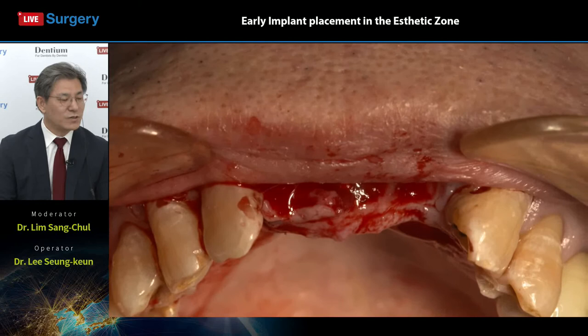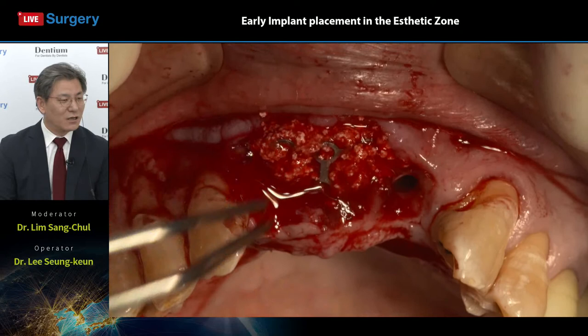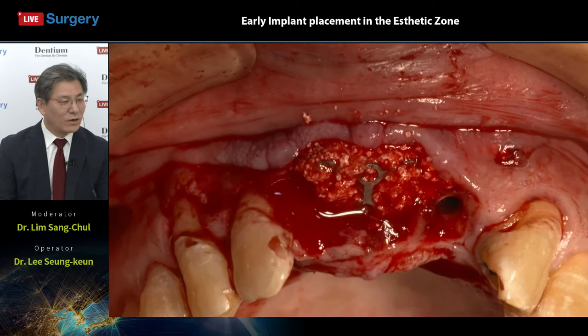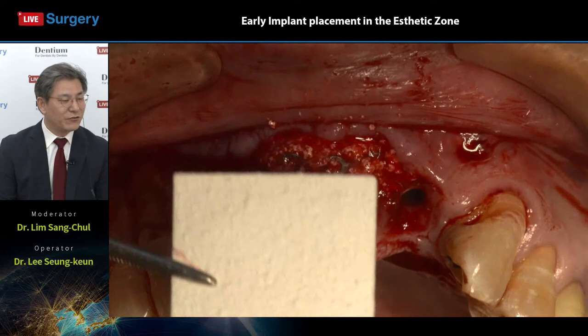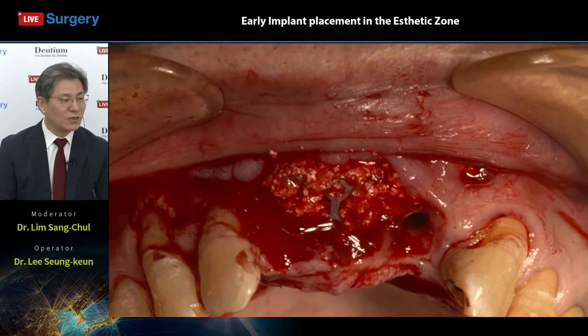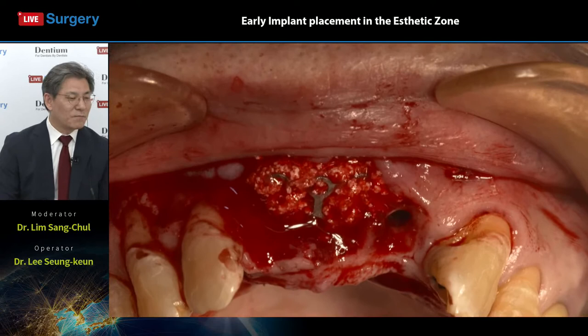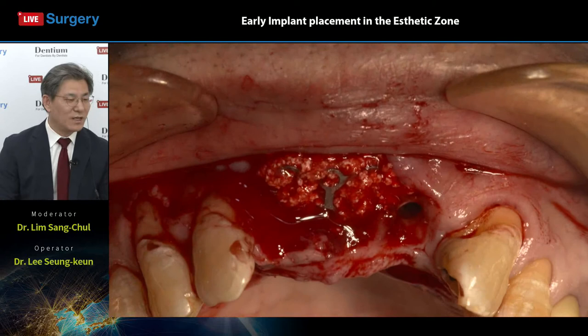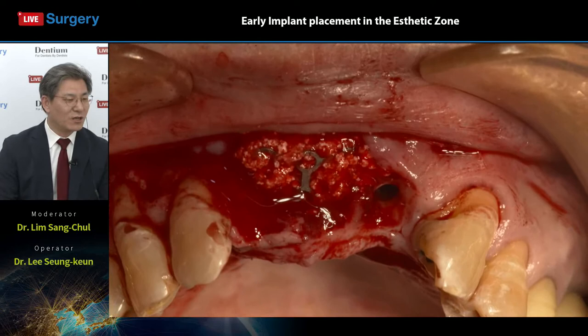So he used Osteon 3 collagen graft material. This versatile graft material is very useful because it is moldable, easy to mold, and holds all the graft material together. The collagen binder holds this Osteon 3 particulated bone, so it is not scattered anymore. Can you see all the graft materials located, concentrated, and contained in this defected area, right? What is the holding material? Collagen. All this collagen holds all the graft material, the Osteon 3 particles, so it is not scattered to the other side.